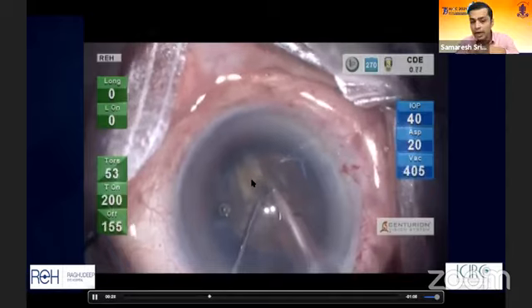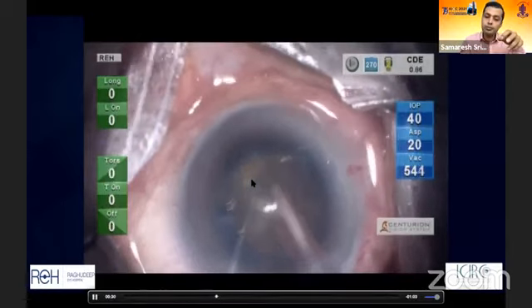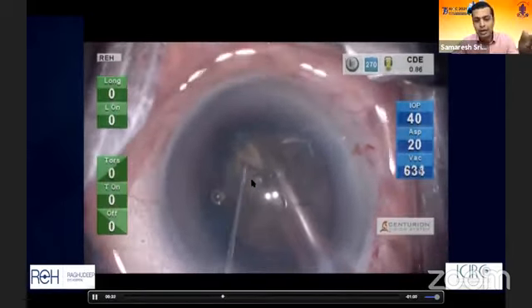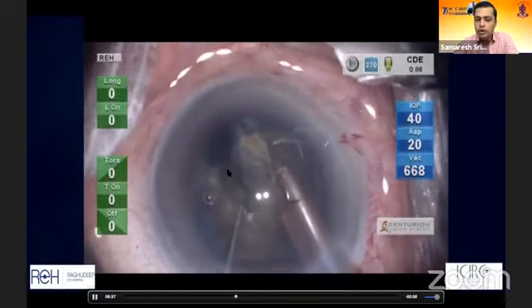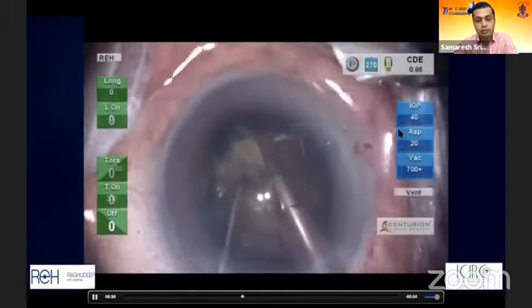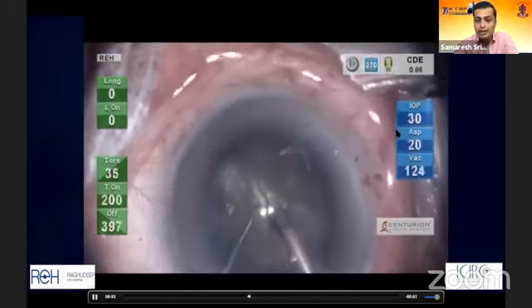Sometimes you may not be able to do that, and what I normally would do is bury the probe at a deeper plane on the same area and go ahead and complete the chop over there. Notice over here that this is a good classical example of a direct chop that was possible due to two things. One, excellent chamber control.